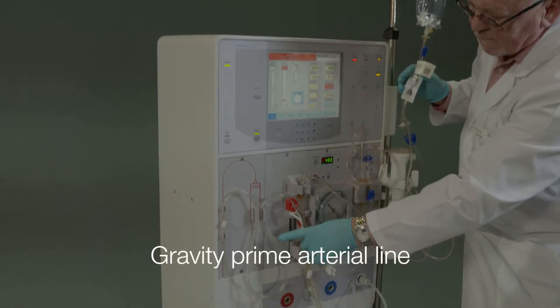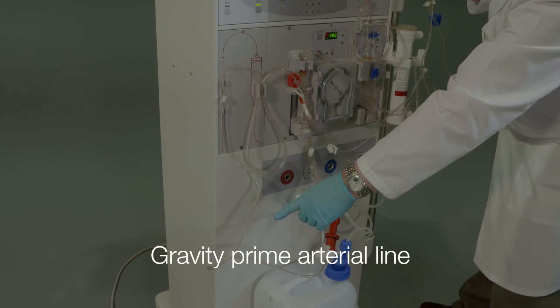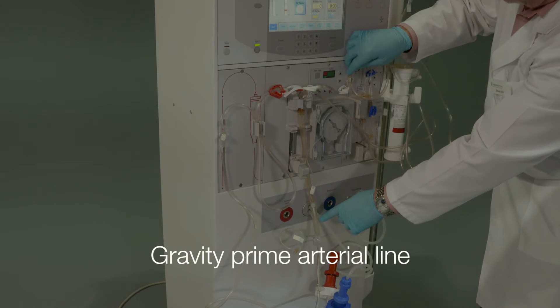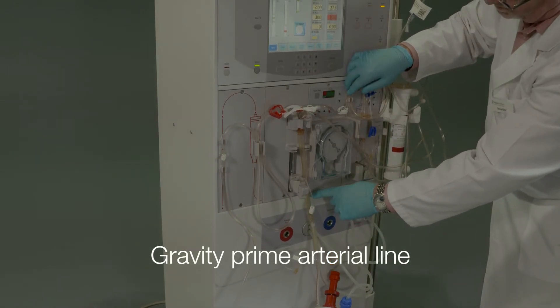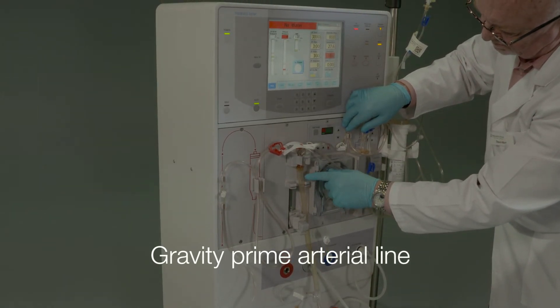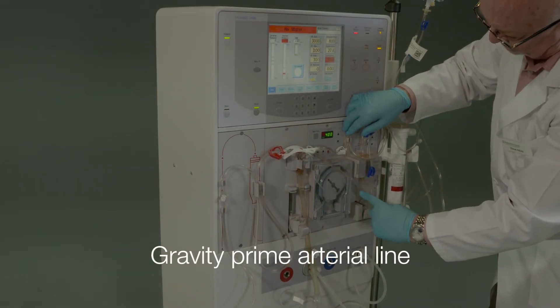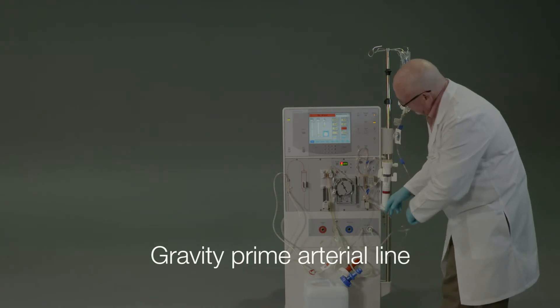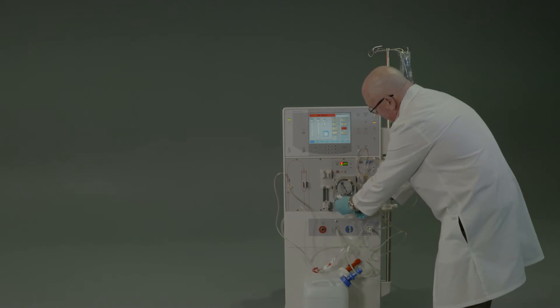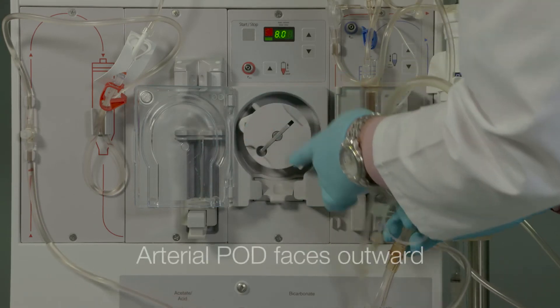Gravity prime the arterial line through the pump segment up to the arterial line connection to the arterial connection of the dialyzer, expelling all air before inserting in the blood pump. The arterial line is completely filled with saline and all air is expelled from the arterial line.